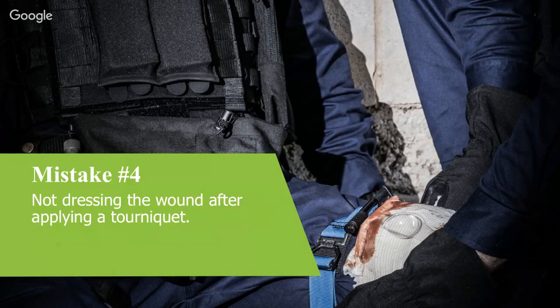So arterial tourniquet straight away in your massive hemorrhage, sort out your airway, check your breathing, make sure there's no tension pneumothorax, any issues there. And then when you come on to C, get back and dress that stump or dress that wound when you can. And then you reassess your tourniquet when it's tactically appropriate or practical to do so. And it may just be that you can loosen the tourniquet and convert it to a pressure dressing.